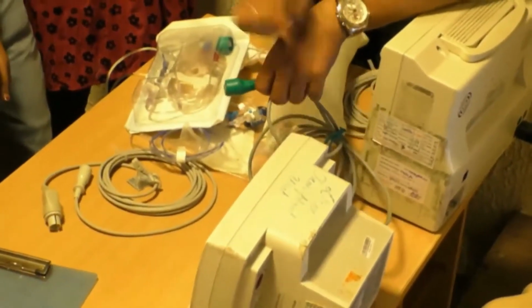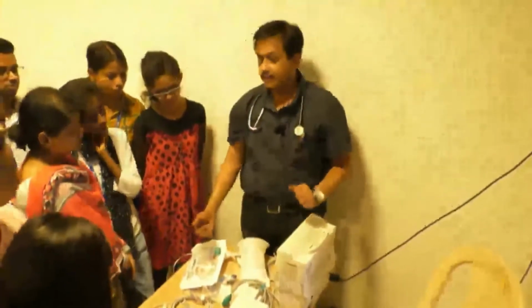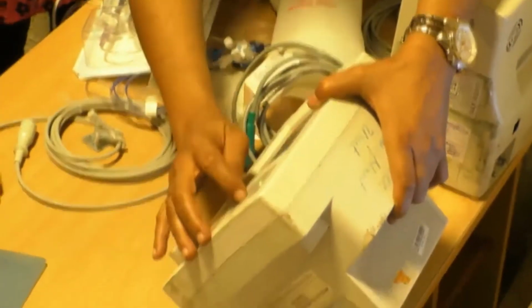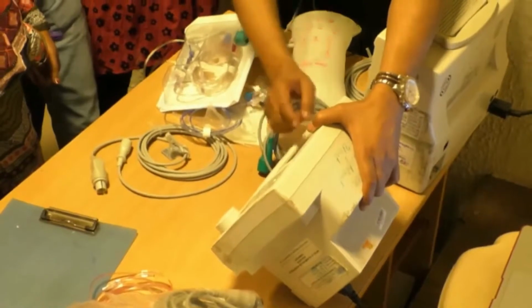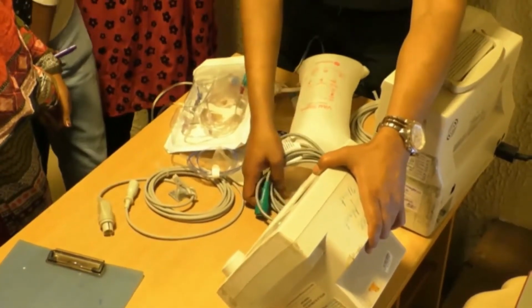What this does is a waveform analysis, right? The kind of arterial waveform I showed you, and from that waveform analysis, it finds out all the hemodynamic data here. Now, since I have only a venous catheter here, it will show cardiac index, stroke volume index, ScvO2, the central venous oxygen saturation, and this is SVV, stroke volume variation. I had talked about stroke volume variation a little bit.